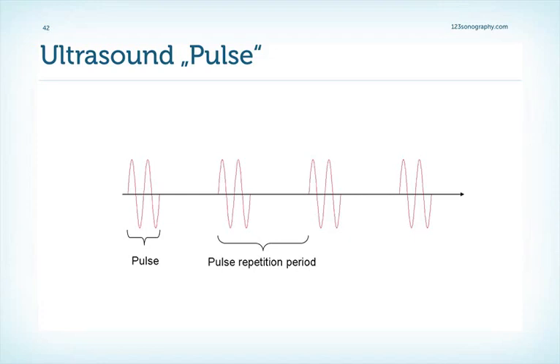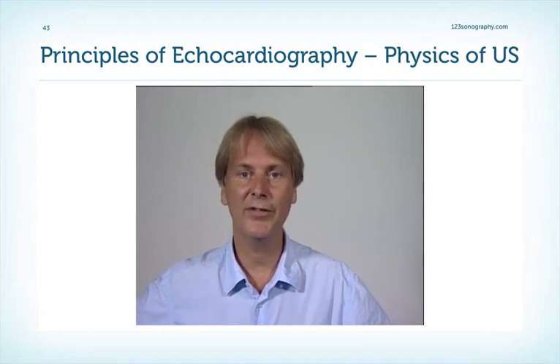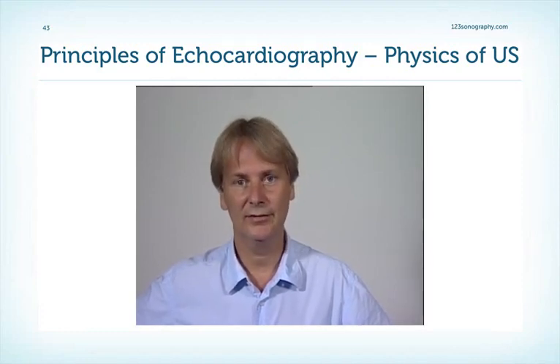And as you will see later in this chapter, it's very important also how long these pulses are and how high the pulse repetition period is, in other words, the interval from one pulse to the other. This will also be an important determinant of image quality. So this concludes the first part of this chapter, the physics of ultrasound.